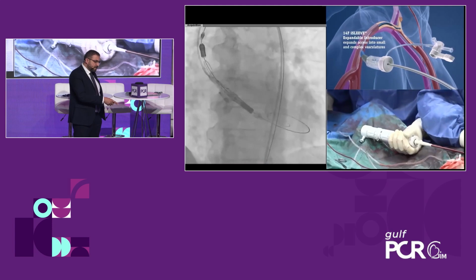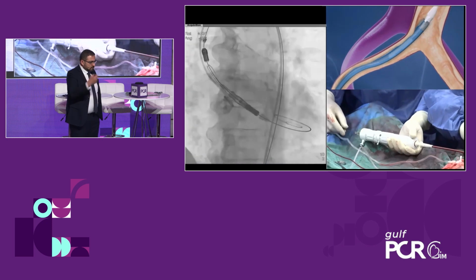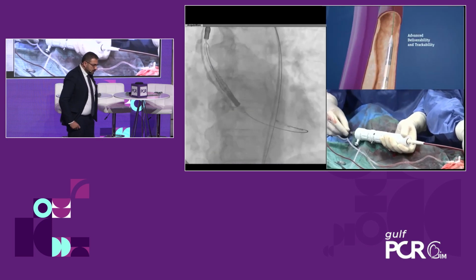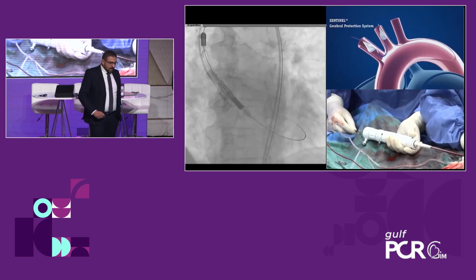struts of the valve platform from the capsule. So what happened here was that the valve went a bit deep. So as I mentioned, we'll take the valve to the ascending aorta again, and then push it once again to achieve the proper deployment depth of the valve.